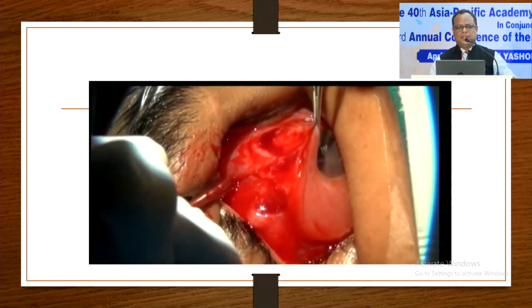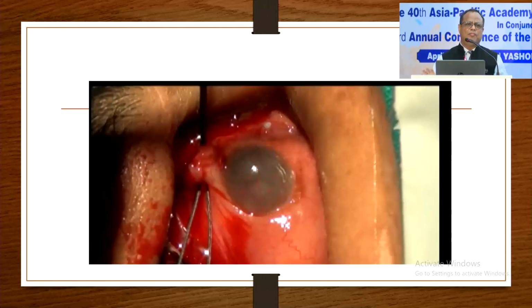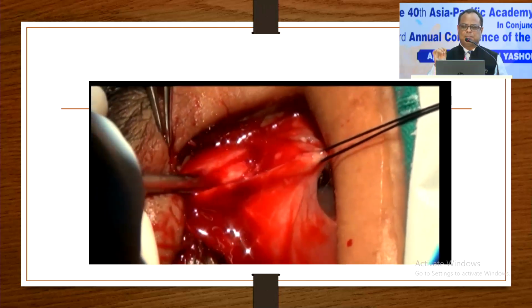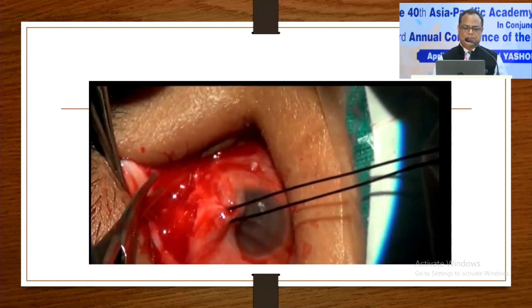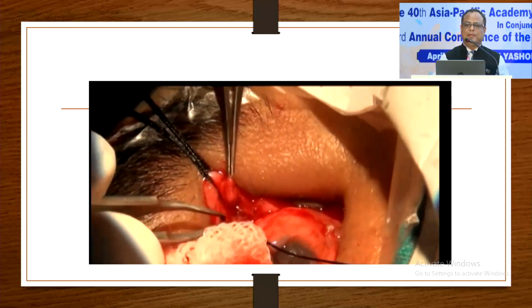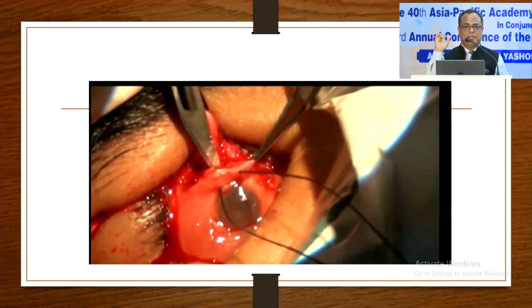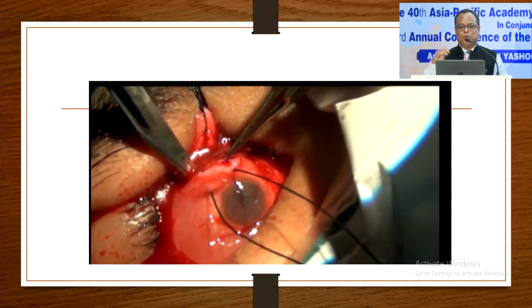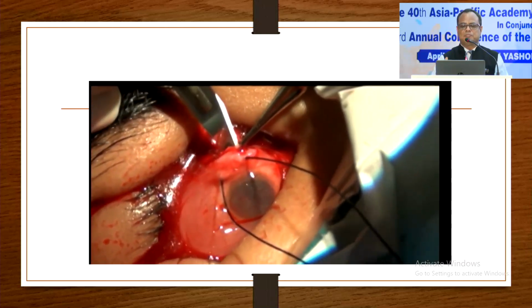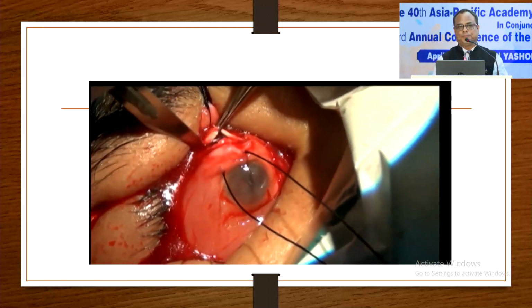A silicone-filled eye, almost 4 or 5 surgeries done, PL negative, painful eye. In such cases also, we can teach our juniors to disinsert the superior rectus and superior oblique, then we can make one curvilinear incision. Mind it, here I am doing the incision not on the limbus. This is a very big beauty. In other eviscerations, you have to sacrifice the limbal stem cell and the tenons, then you can open. The silicone oil comes out, then you can insert everything through that one.